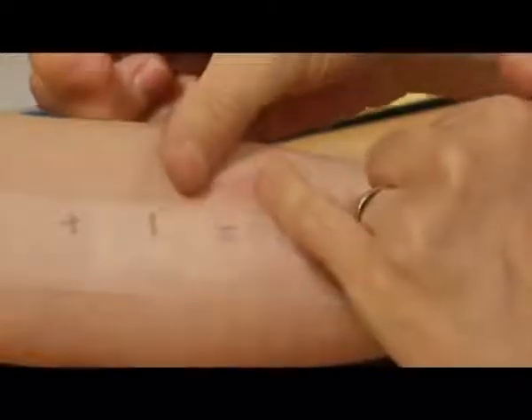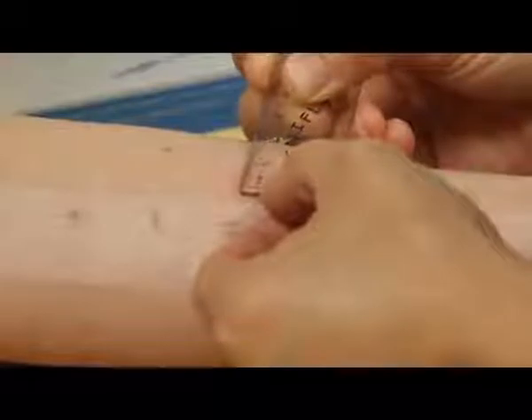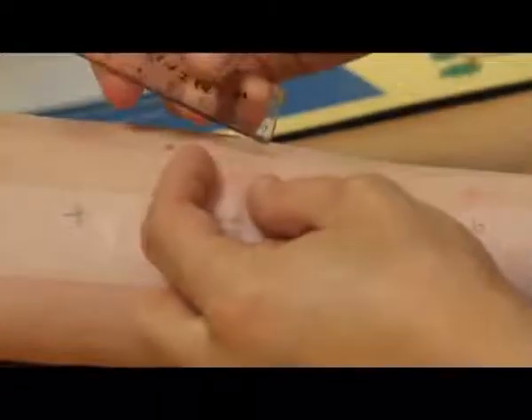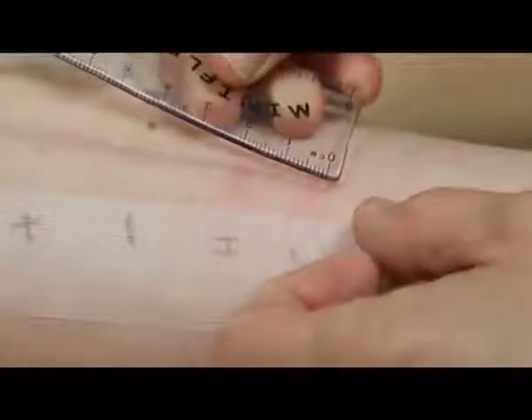Now this is your house dust mite, and you've got a bit of a funny shape, Laura. And what we measure is that white lump in the middle. So this is where it gets really high tech, we use a ruler. And we are looking at six millimeters, five by three. So that's definitely a positive. But that's your house dust mite. So we're now onto your cat. And again, if I press on there, you can just get the redness to go away. You can see that you've got a nice lump in the middle there which we'll measure. And that is five by five by three. So that again is a positive.